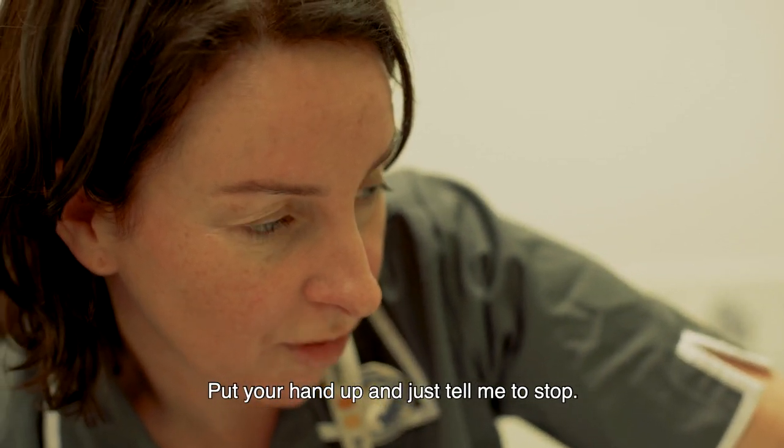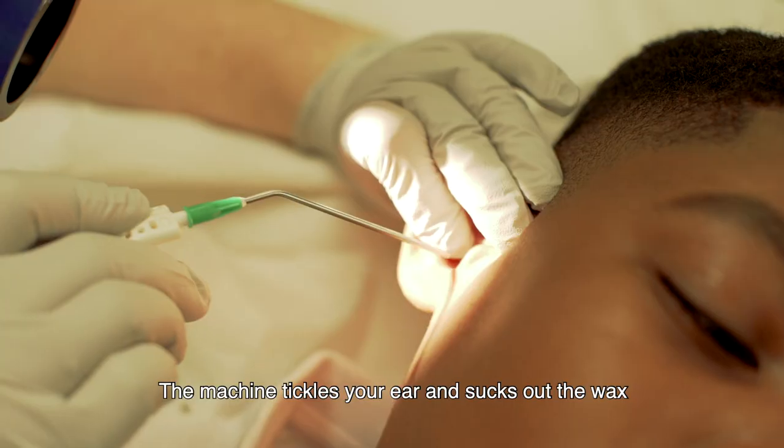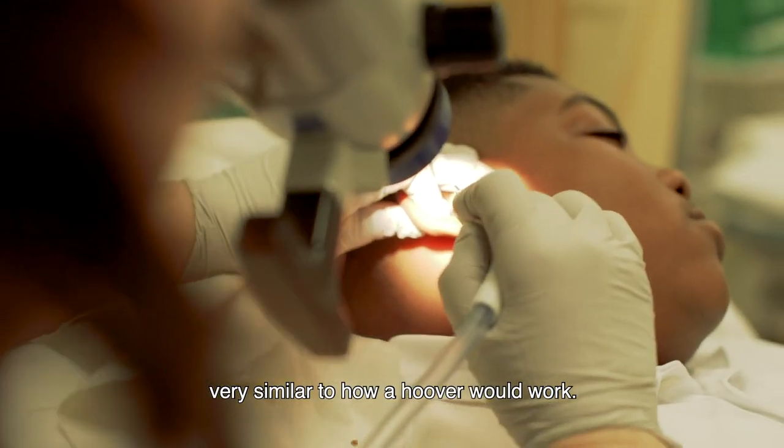Put your hand up and just tell me to stop — try not to move. Are you ready? The machine tickles your ear and sucks out the wax, very similar to how a hoover would work.